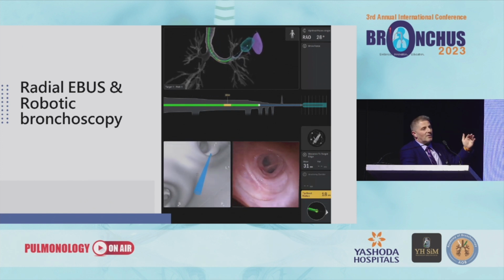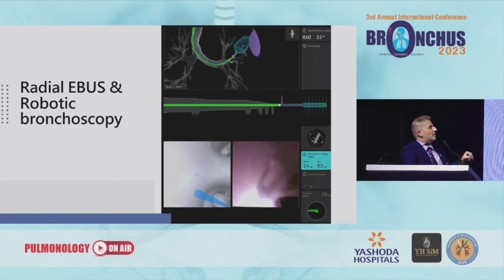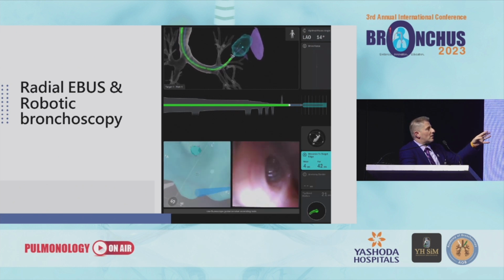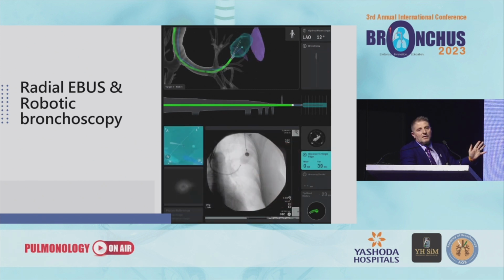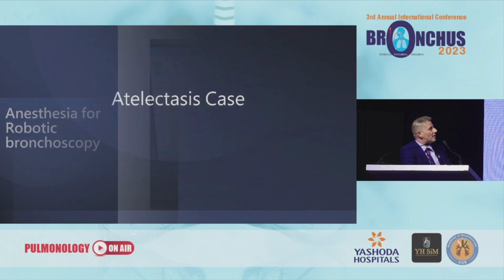And with this size of lesions, usually you really see an endobronchial lesion. You can even see it visually matching your area, and here you can see the tumor blocking that bronchus. Now, I know that from parking there, the catheter will not move anywhere. Then sometimes I also confirm with radial EBUS just to show that we are concentric, and collect the samples from there, which can help.